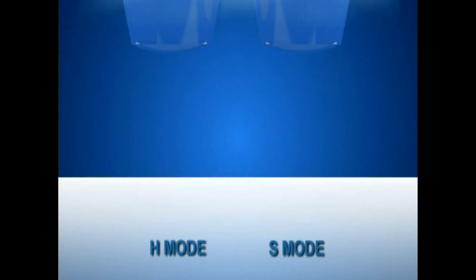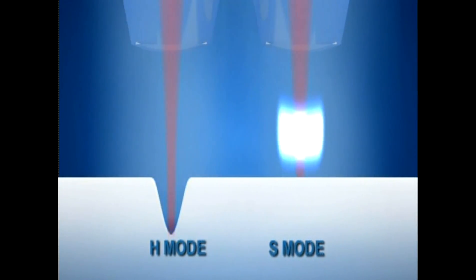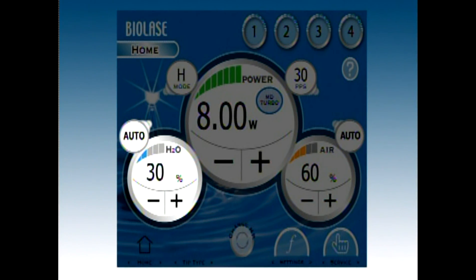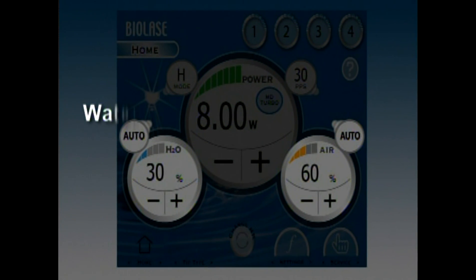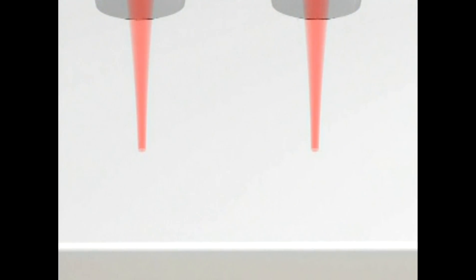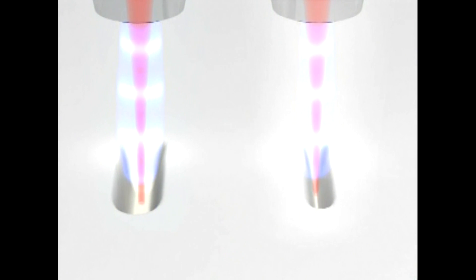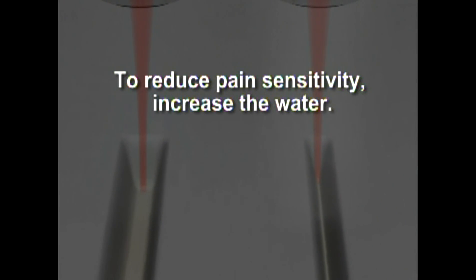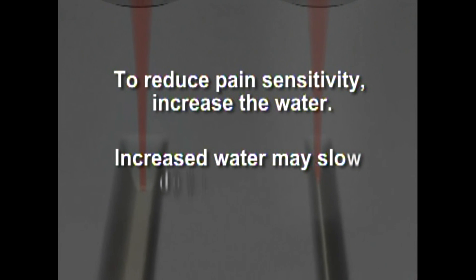H mode is used for all hard tissue cutting; S mode will not cut hard tissue. Hard tissue requires significant amounts of water spray in comparison to soft tissue procedures. 30% water and 60% air is a good starting point for air water spray settings. Water level below 25% or no water will produce charring. A good ratio is one part water to two parts air. Simply watch your results and adjust as needed. To reduce pain sensitivity, increase the water, though increased water may slow down the cutting.